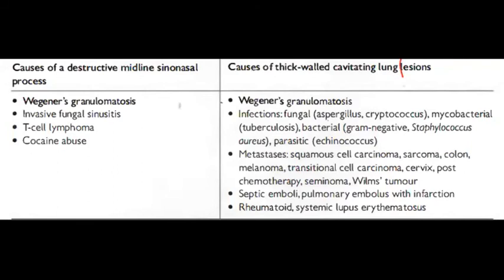In this patient, you will search in the trachea. So you will search the trachea for what you think you can find, but it is not in this case. Tracheobronchial stenosis. Yes.